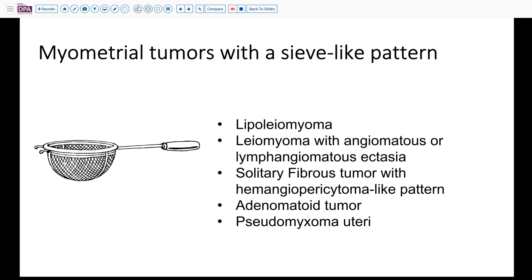In tissue, things that give you that clear space with a mesh-like appearance are things like lipoleiomyoma, which can occur in the myometrium — especially if you have a high fat content lesion, that could give you a sieve-like pattern. But certainly that doesn't fit with what we were seeing in terms of the cuboidal cells and so forth. We could think about a leiomyoma with angiomatous or lymphangiomatous ectasia as a possibility, in which case we'd want to see that the intervening cells had more smooth muscle characteristics rather than fibroblastic type features. A rare entity might be a solitary fibrous tumor, which would be quite unusual in the uterine corpus with a hemangiopericytoma-like pattern.